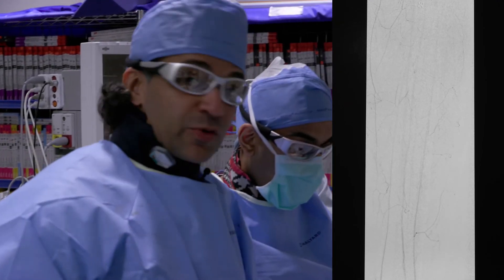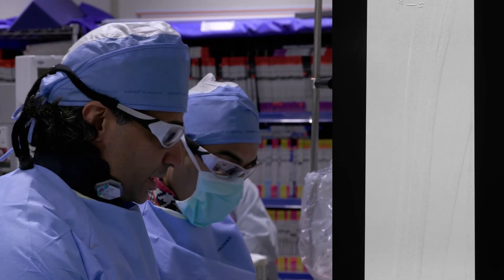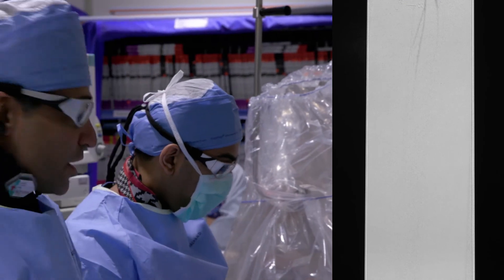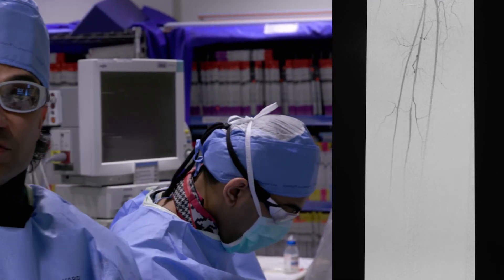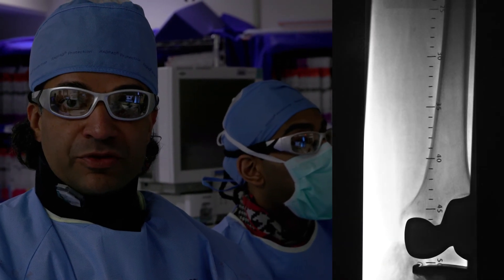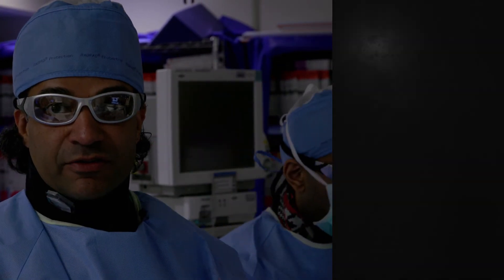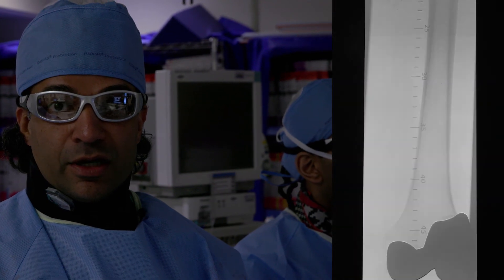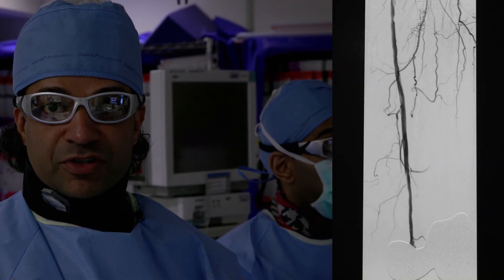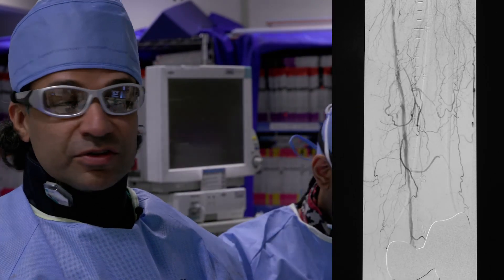So again, great imaging. We crossed with the Ocelot device. We had a large proximal collateral that we got through with our Ocelot. Went through a lot of plaque and then cleaned up with the Pantheris device. Followed with the DCB. No distal occlusions. Excellent flow at the end of the procedure. Less than 10% residual stenosis.